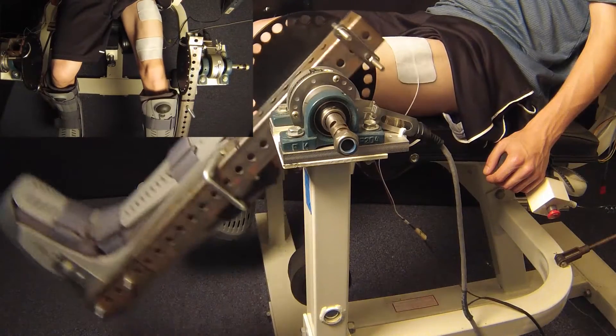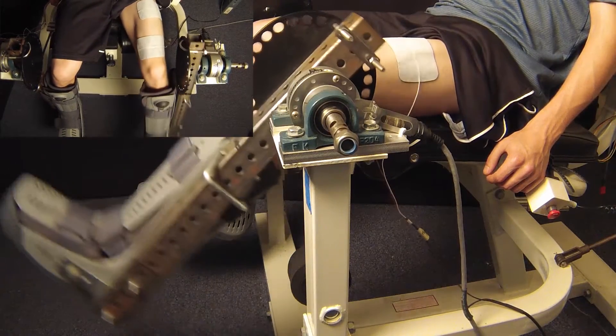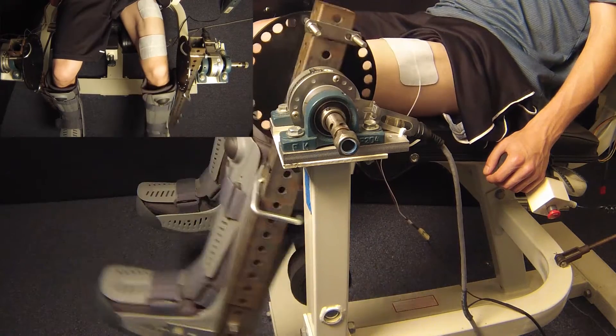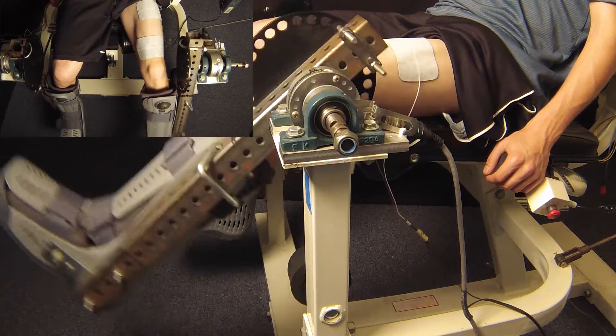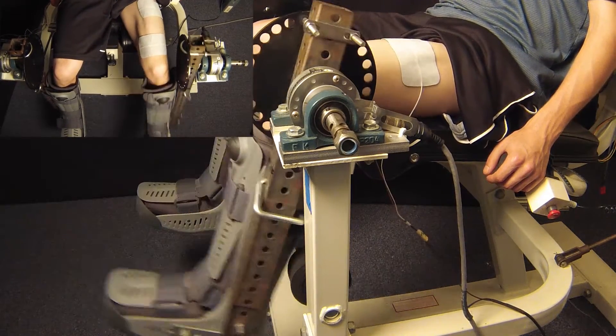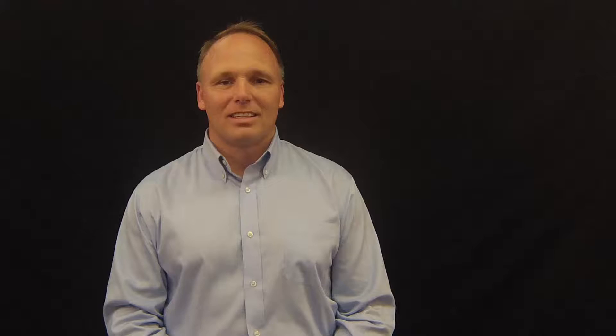Electrical stimulation has a long history of being prescribed for the restoration of various body functions. In the Non-linear Control and Robotics group at the University of Florida, we focused on how to intelligently shape and apply the electric field to yield desired muscle contractions in the lower body to produce desired limb motion.